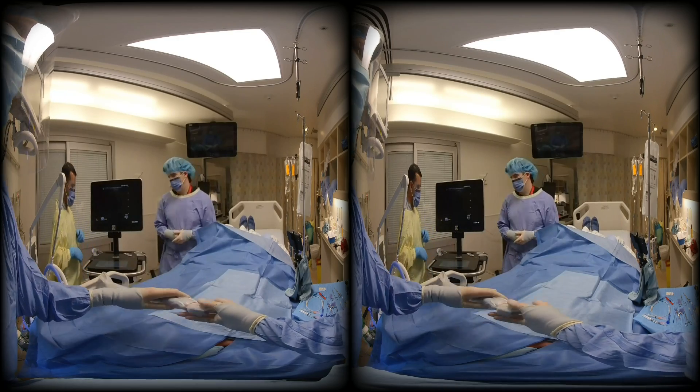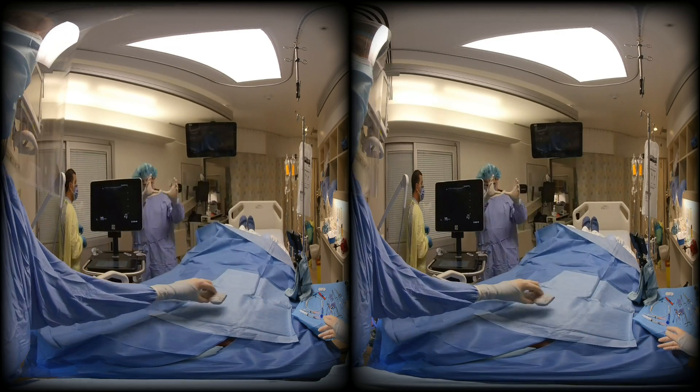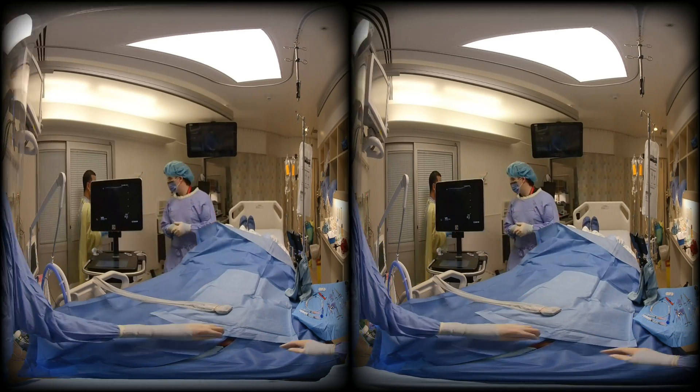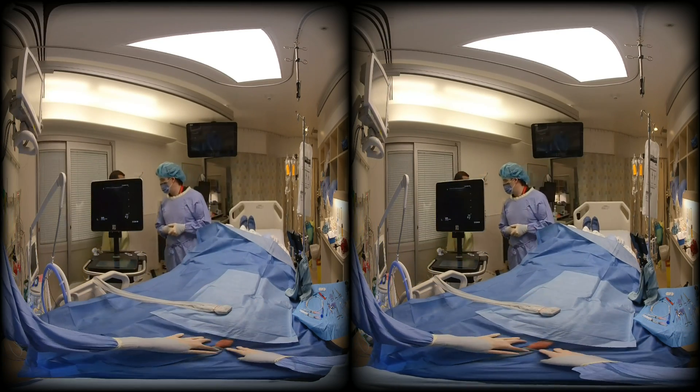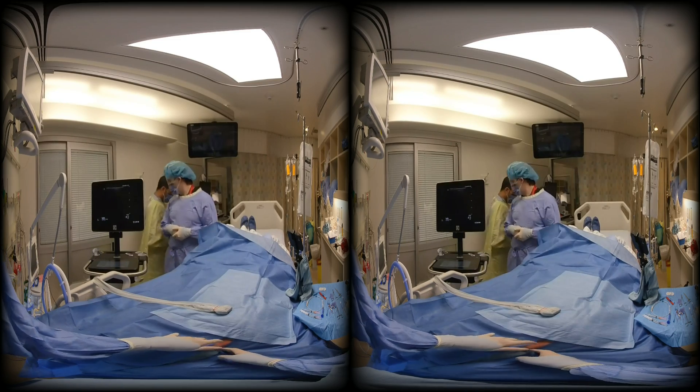You've done it nicely here — put it in a secure place to prevent it slipping off.